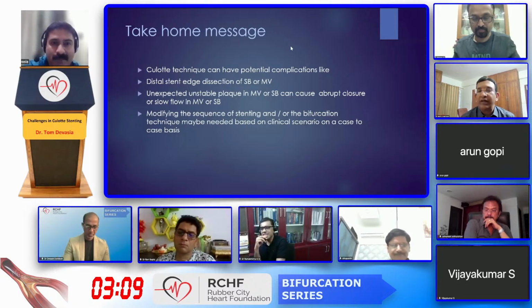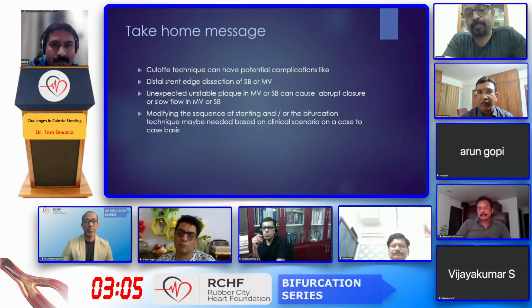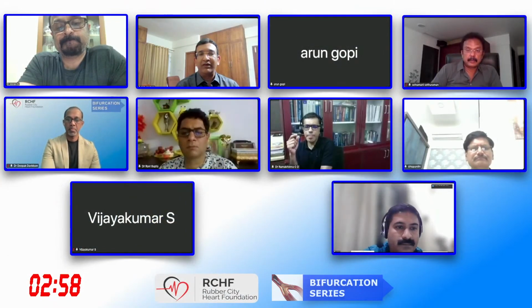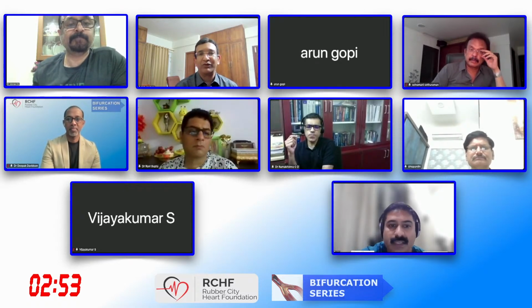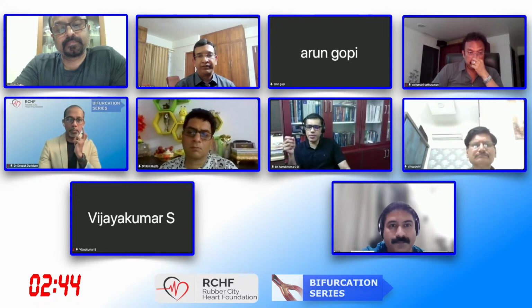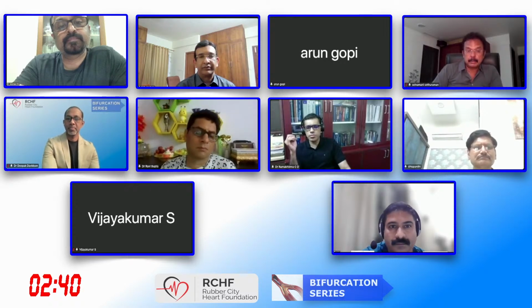But Tom, when you didn't see the diagonal, you stented the diagonal because there was no flow in the diagonal and you couldn't see the distal vessel, isn't it? The diagonal was totally occluded from the beginning. So in which case, 2.75 probably was an oversight. Probably, yeah. Into the main vessel? Less than 10 mm. So do you think the size difference between the LAD and diagonal is significantly different to take up Culotte in this case?